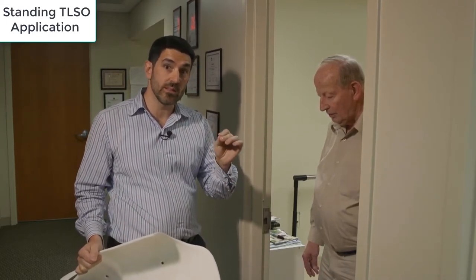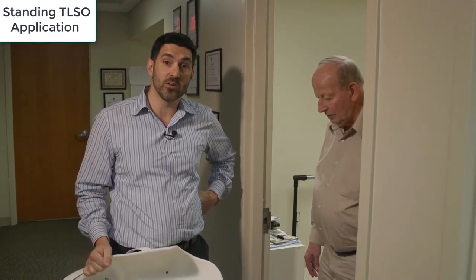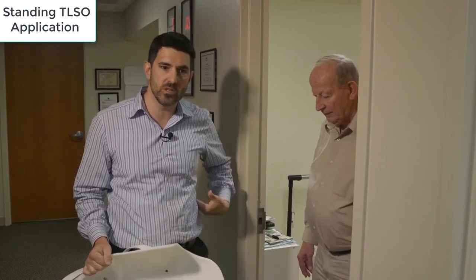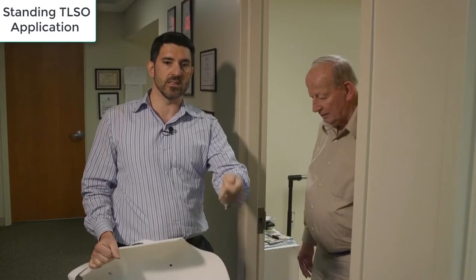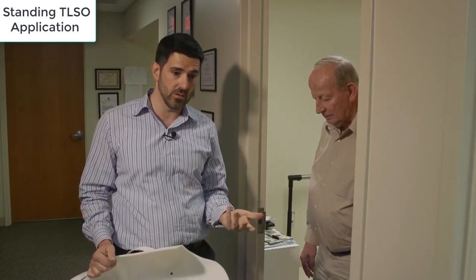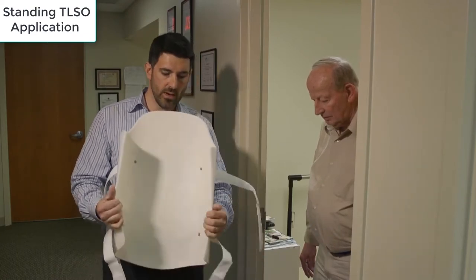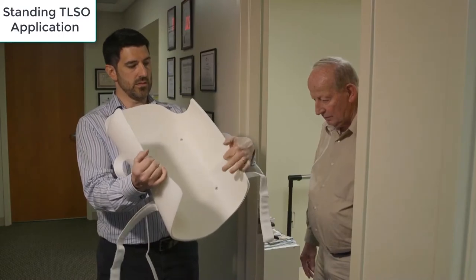The reason why we put it there is that it can go on top of a person's iliac crest, and the patient knows this is exactly where I put this piece. If I do this next step this way, I know I'm doing my brace right — because patients have very little experience with it, especially in the beginning. There's a slight padded waist groove right there.